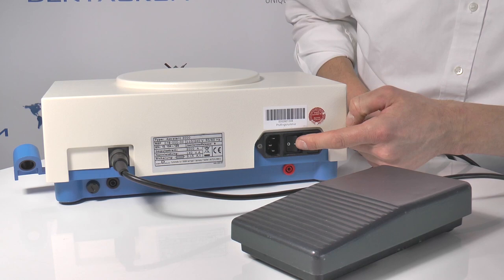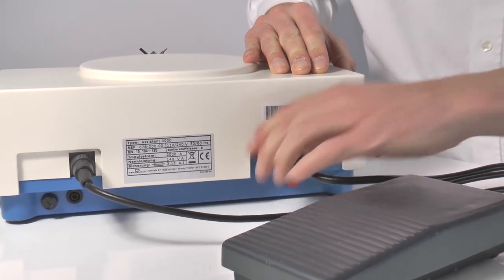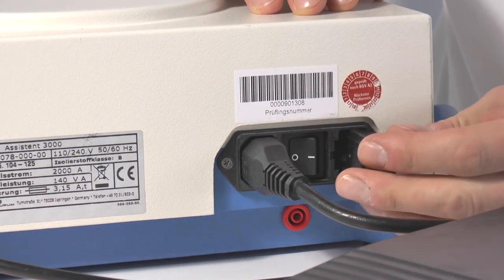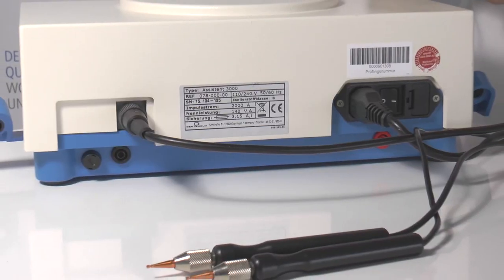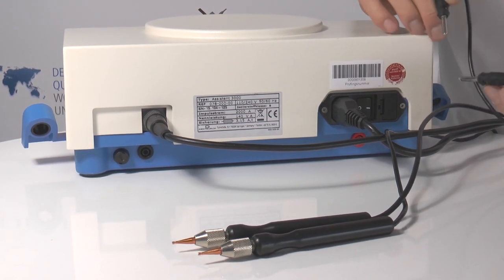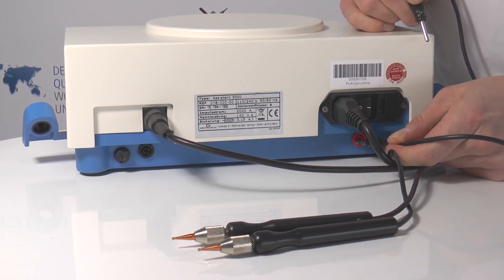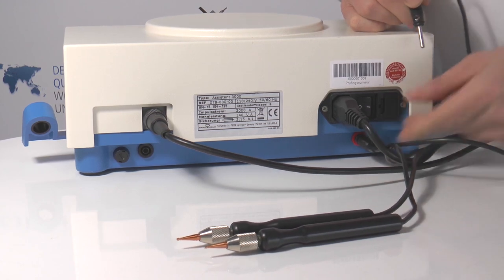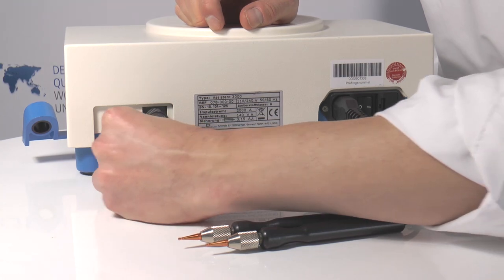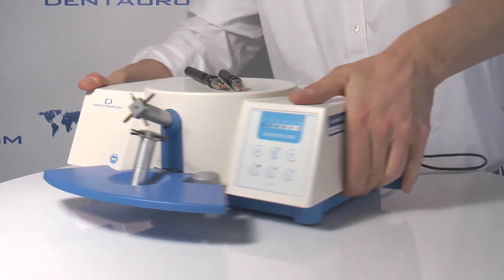This is the main switch, the power plug, and this is the fuse. Now the hand electrodes — you can plug them in here. If you have the clickstop holders on each side you can put them away.